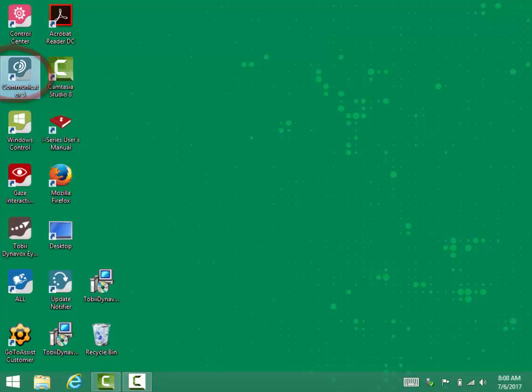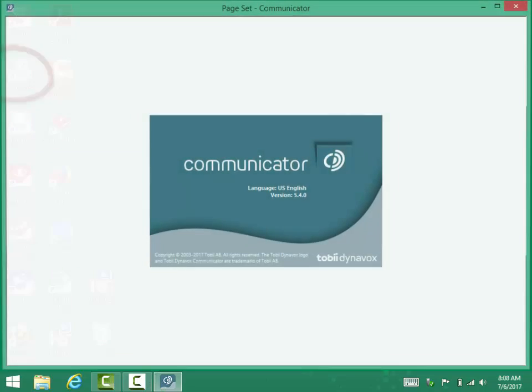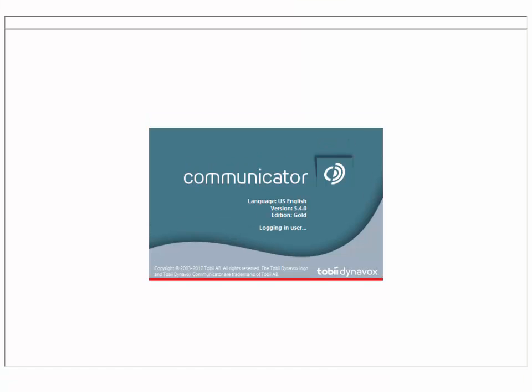You'll double-click on Communicator 5. It's a rather large program, so it does take a few moments to load. And here it is. It should open to the page set that's been customized for the particular user, and once it's positioned for them to access with their eyes, they will be able to control it automatically.